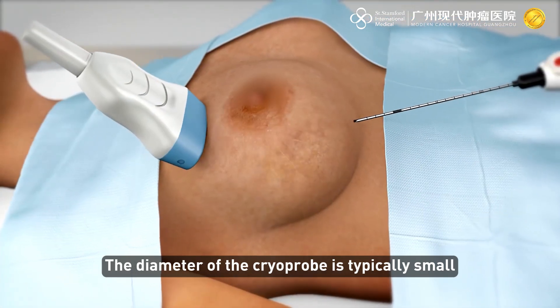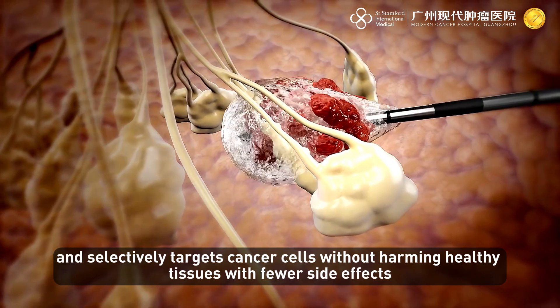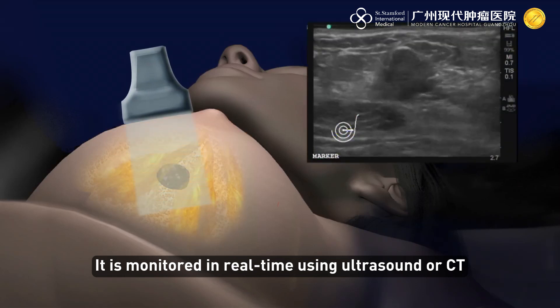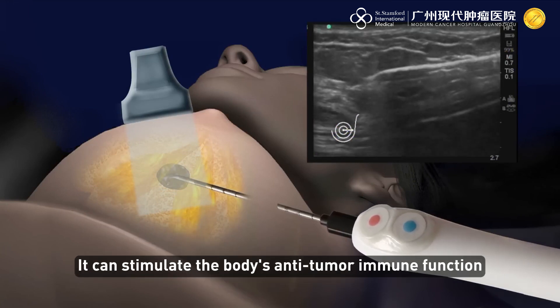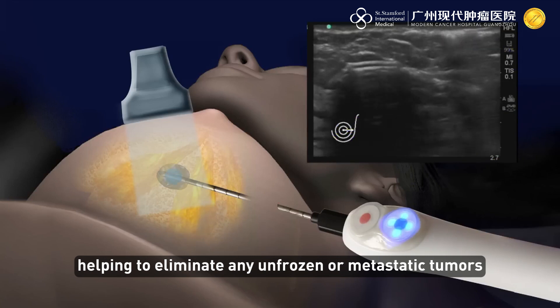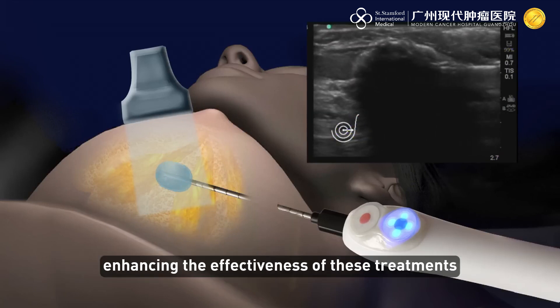The small cryoprobe selectively targets cancer cells without harming healthy tissues. It can stimulate the body's anti-tumor immune function, helping to eliminate unfrozen or metastatic tumors. Frozen cancer cells also become more sensitive to chemotherapy or radiotherapy, enhancing the effectiveness of these treatments.